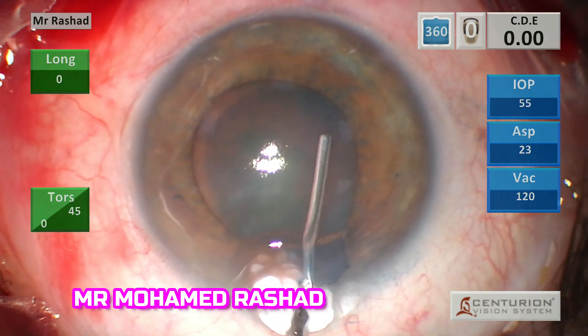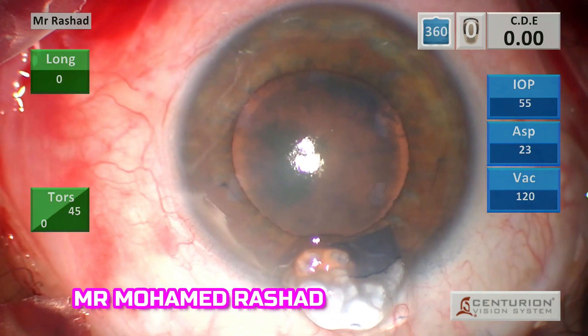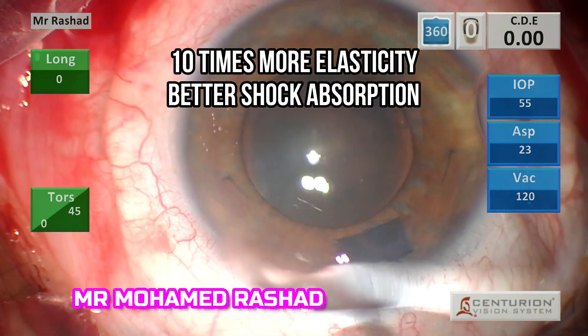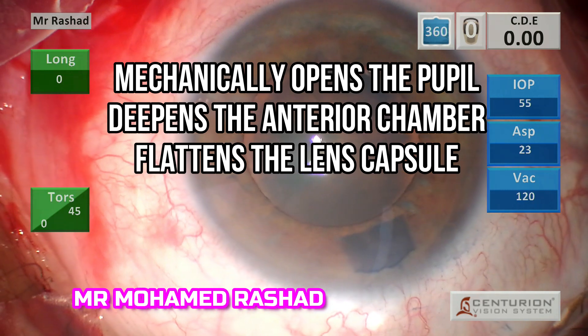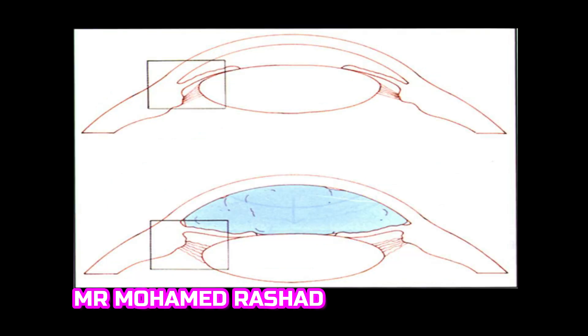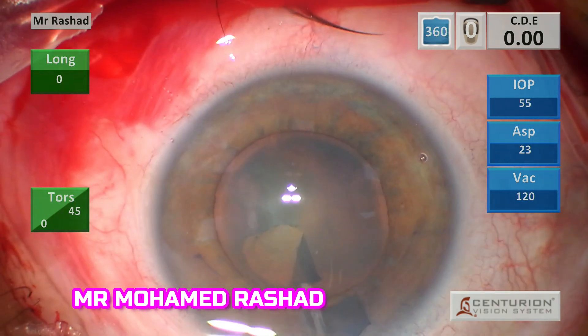You can see the pupil is dilated now and it maintains the dilation. Healon GVA is ten times more elastic than usual Healon and it is super viscous. I put some dispersive viscoelastic on the cornea — it mechanically opens the pupil, deepens the anterior chamber, and flattens the lens capsule. You can see how viscous it is compared to usual Healon. Go at 6 o'clock opposite the incision and fill all the anterior chamber; this will flatten the capsule and relax the zonules.